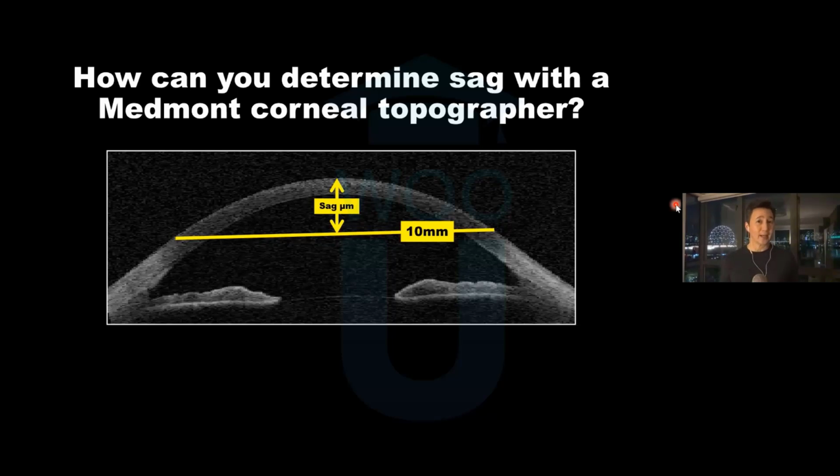And that's half the story in building the depth of eye that you need. The second part of the story is to determine the angle that begins to form out there at 10 millimeters and runs right past the limbus and sclera. So if we can get information on the peripheral cornea, then we could predict the height of lens that we may need in the center, the sagittal depth of lens that we'll require.